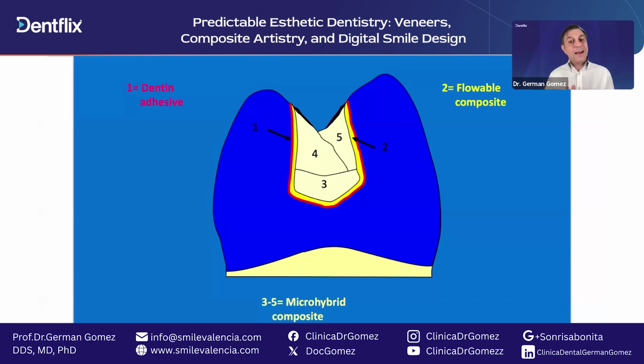In the back, we layer differently in the interproximal than in the center of the cavity. For example, here, that's an interproximal view of a tooth in between the teeth. So we are at the adjacent tooth and we look at this tooth right now, and we are making the wall that will touch the adjacent tooth.